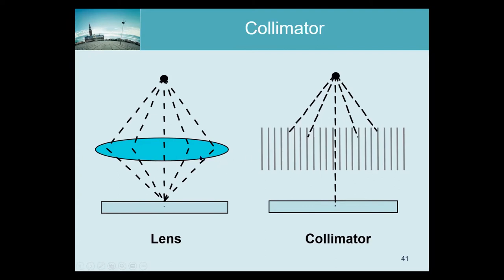So ideally, you would want to use a lens as in photography. If you don't have a lens, you will have uniform illumination of your detector, and you would get a lot of photons, but no image. Same here, if we do away with the collimator, we have the same problem. So of course, we would prefer to use a lens, because with a lens, all these photons that hit the lens are used to make an image. So that's very good for the noise characteristics.